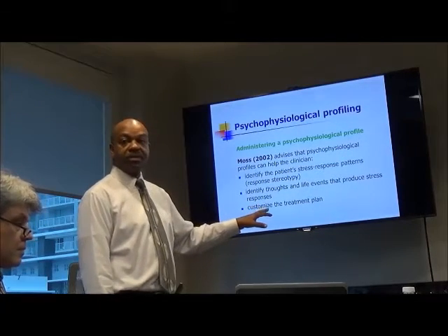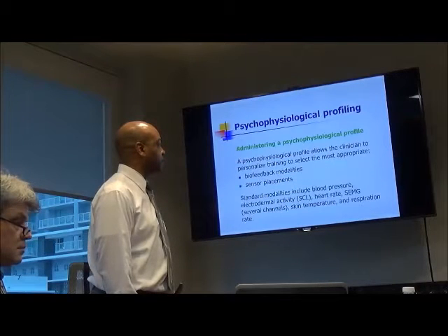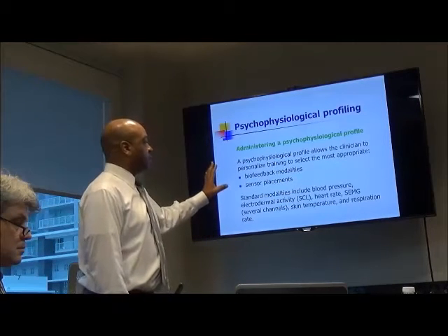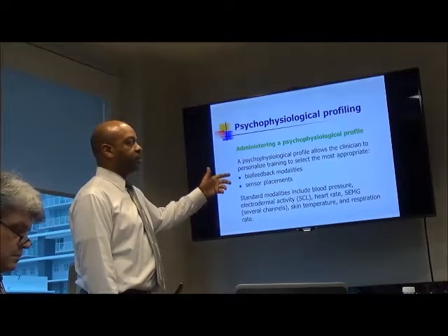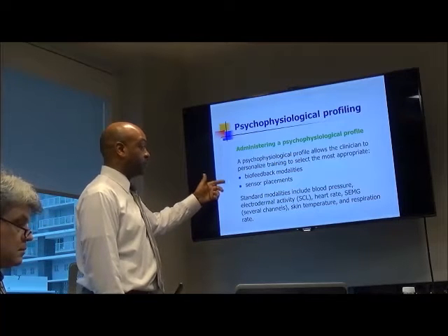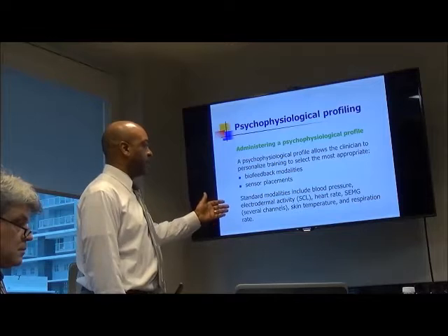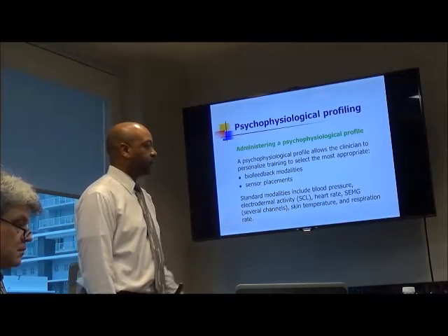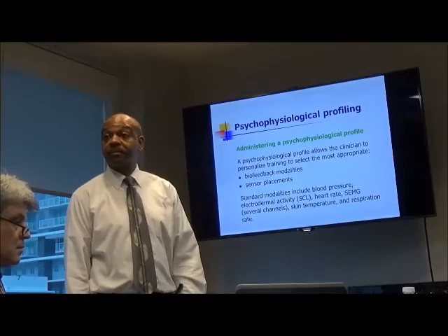And then you can use that information to customize the plan that you're going to use with them. So you want to, based on the information you gather from the stress profile, decide what modalities you're going to focus on, the sensor placements also, and these are, again, the things that we would normally include in the stress assessment.